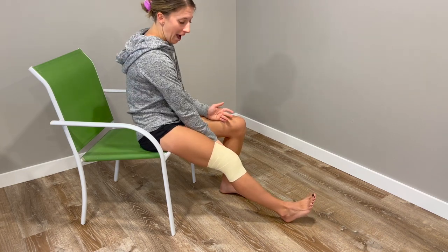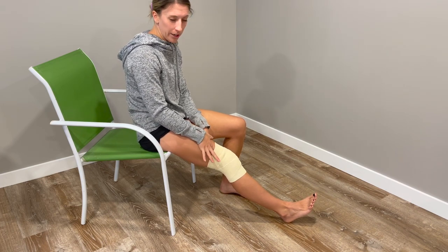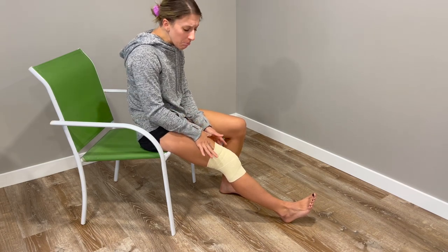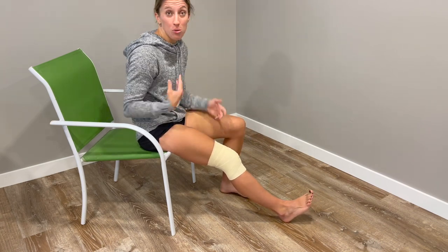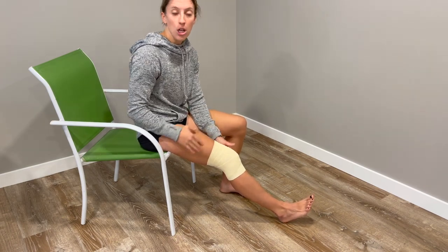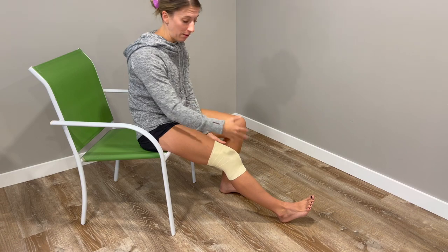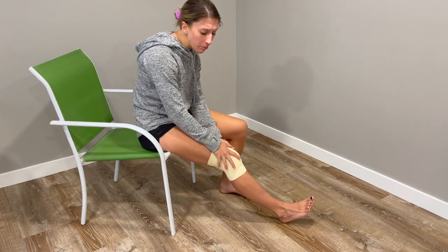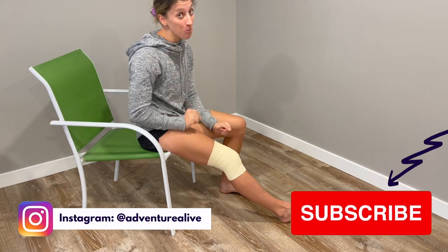Now you have a wrapped knee. You want to make sure you can at least slide one finger underneath. If you can fit more than one finger, it may not be tight enough. Start with the one-finger test, and if it feels too tight as you're moving around — or your toes are going numb — loosen it up. Make sure it's providing compression without cutting off your circulation, and that you can move in it.